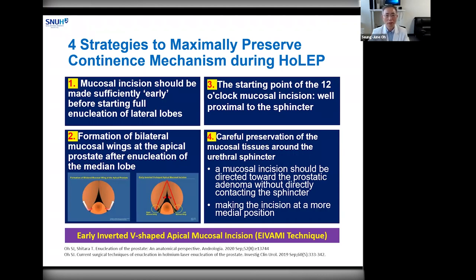First, the mucosal incision should be made sufficiently early before you start to fully enucleate lateral lobes. The mucosal incision is created bilaterally, initially on both sides of the verumontanum. These incisions can be easily extended more distally, even into the deep bulbous urinary area, as a form of a long mucosal tear while you continue to fully enucleate lateral lobes. This can damage the whole urinary mucosal integrity over the urinary sphincter. Second, the formation of bilateral mucosal wings at the prostatic apex helps you to identify the boundary of the circular sphincter structure clearly at 5 to 7 o'clock position at the prostatic apical area.